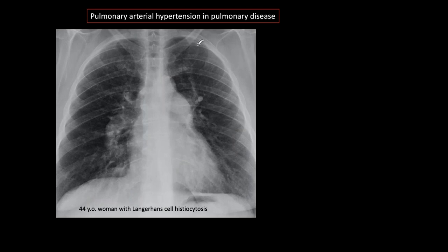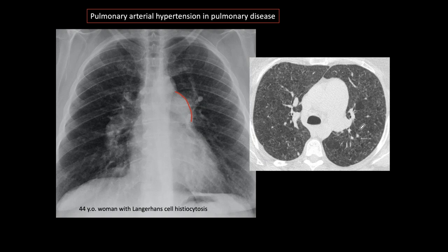Here we have a nice example of pulmonary artery hypertension in pulmonary disease — a 44-year-old woman with Langerhans cell histiocytosis. There are some diffuse, ill-defined abnormalities with no clear pattern. But what is clear is an obvious convexity of the pulmonary artery segment, large hila, and very limited vascularity in the periphery — typical signs of pulmonary arterial hypertension. CT demonstrates the diffuse affectation of the lungs and the marked increase in size of the pulmonary artery compared to the aorta, a sign of pulmonary arterial hypertension.